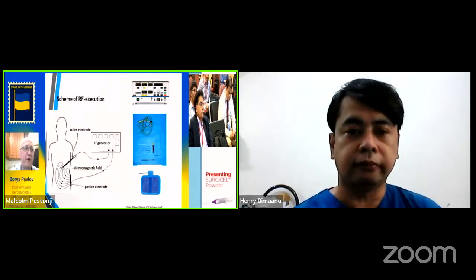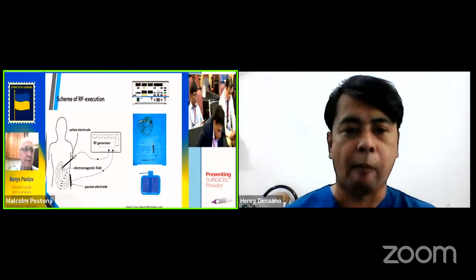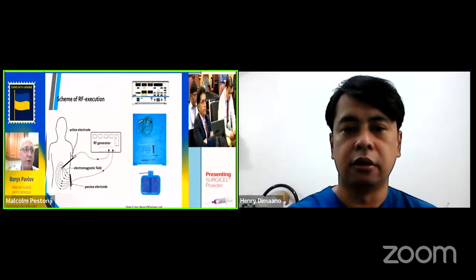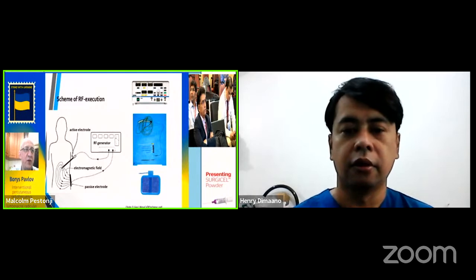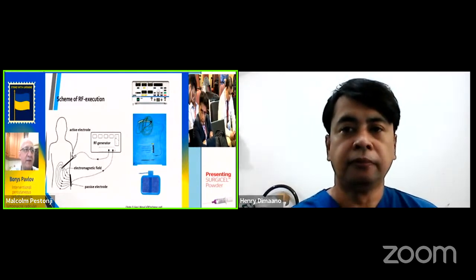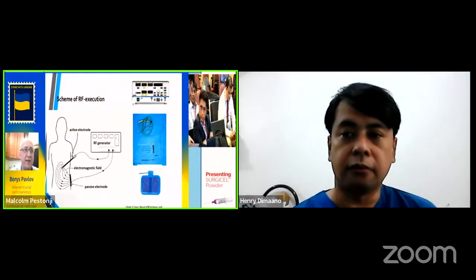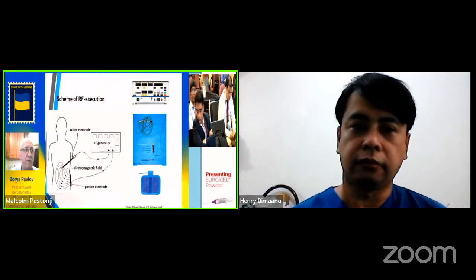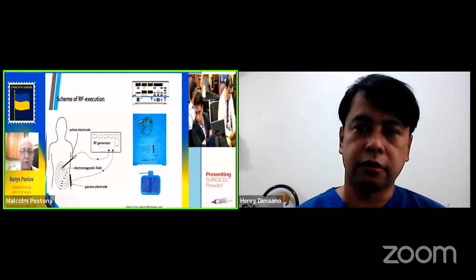The general scheme of radio frequency action is as follows. The active electrode is located paraneurally. The passive electrode is located on the skin above a large muscle mass, for example in the gluteal region or in the scapula region. After connecting the radio frequency generator, around the tip of the active electrode, an electromagnetic field arises, which has, depending on the specified parameters, a therapeutic effect. On the right side of the slide, you can see the radio frequency generator, set of cannulas, active electrode, and the passive electrode.